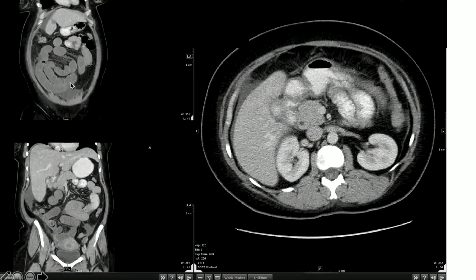Having the amount of free fluid with slight decreased enhancement of the wall, we should raise the concern of bowel ischemia. This is a high-grade mechanical bowel obstruction caused by gallstone ileus with features of impending ischemia.